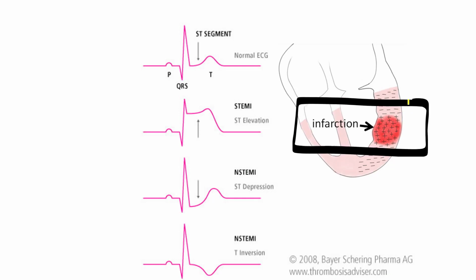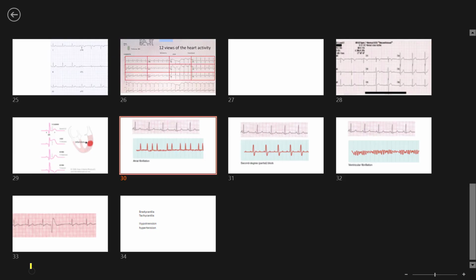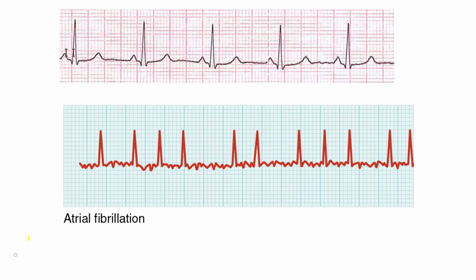One of the things you might see in some 12 lead ECGs might be a heart attack. A heart attack is kind of interesting because a group of cells aren't repolarizing and depolarizing correctly, and it seems to affect the ST segment. The ST segment is that little short flat line, usually between the end of the QRS and the beginning of the T. Well, in people with a heart attack, because of that electrical disturbance in those damaged cells, the ST segment can elevate, and that's called ST segment elevation, or sometimes STEMI, and that can indicate a heart attack.